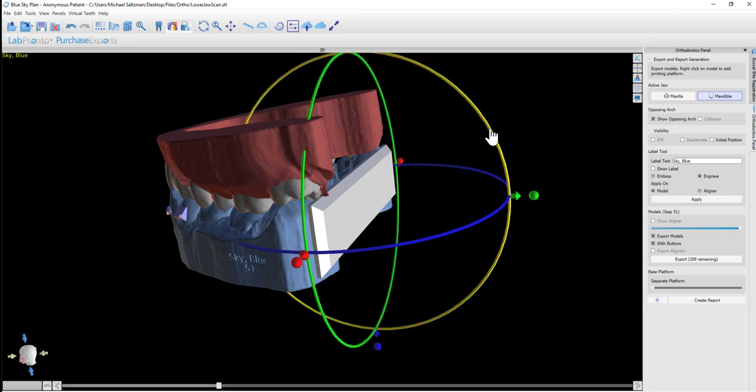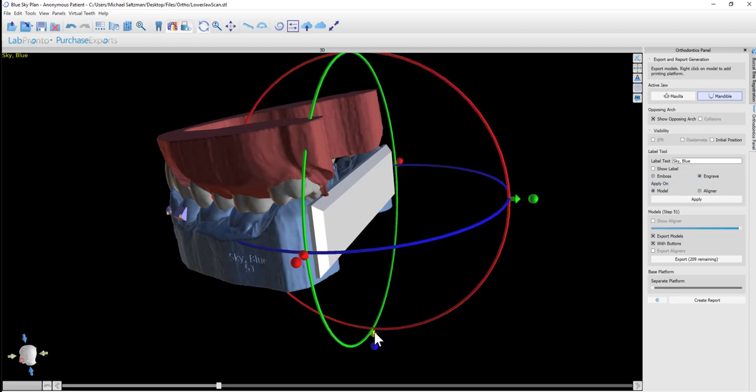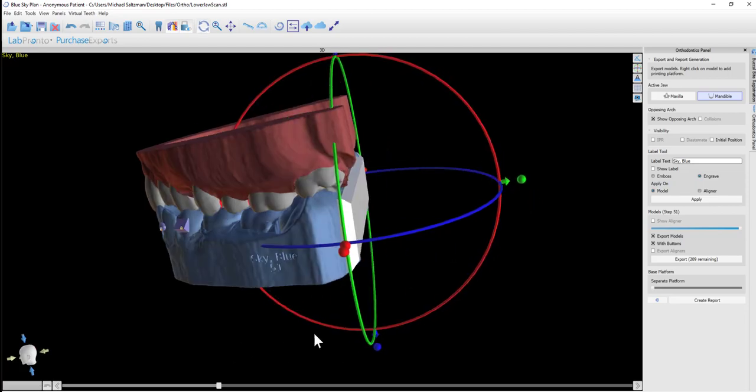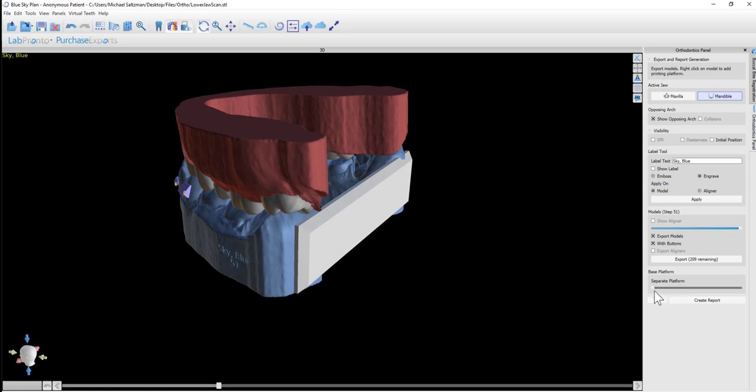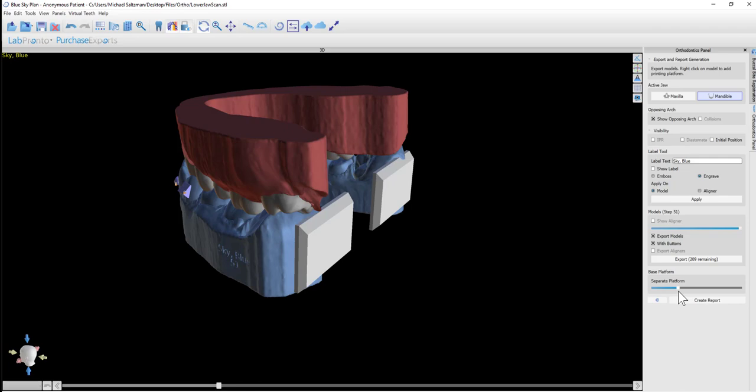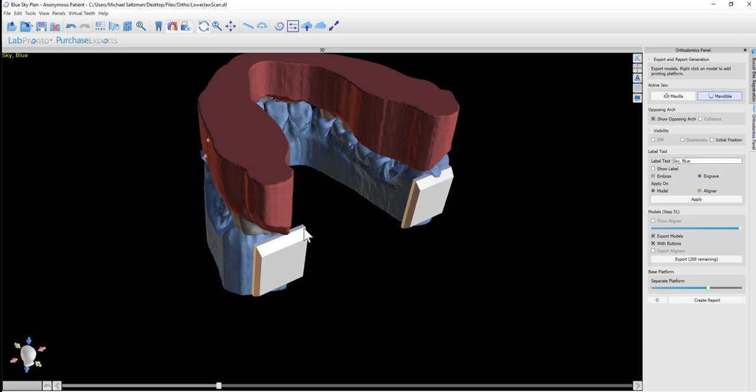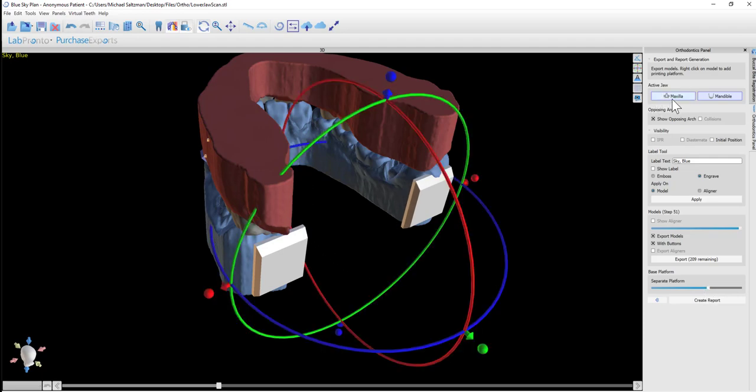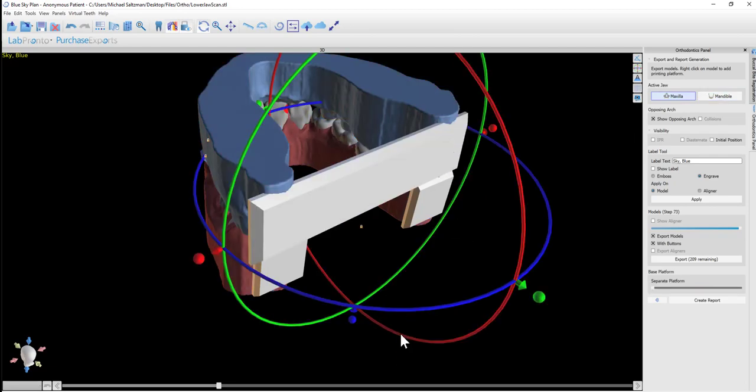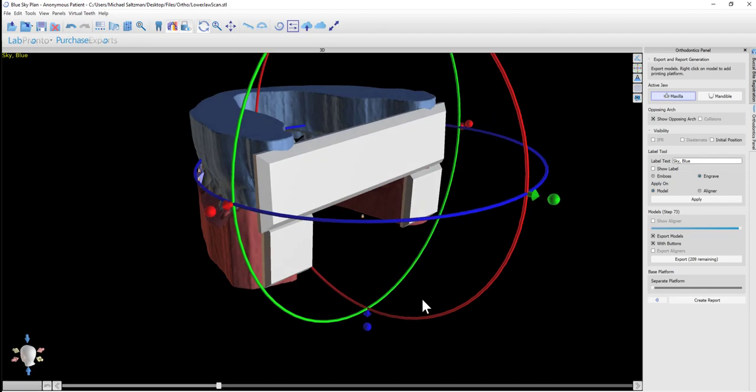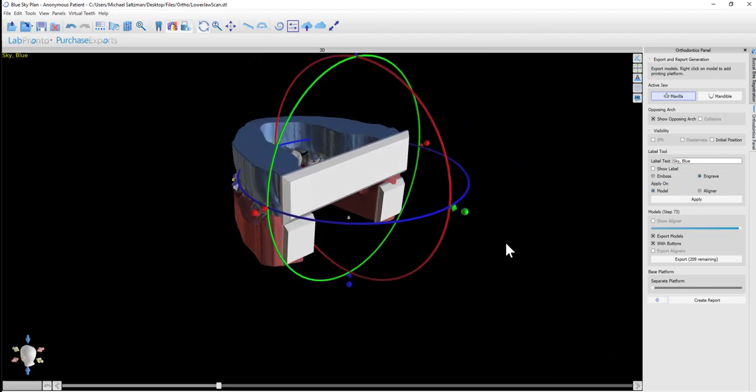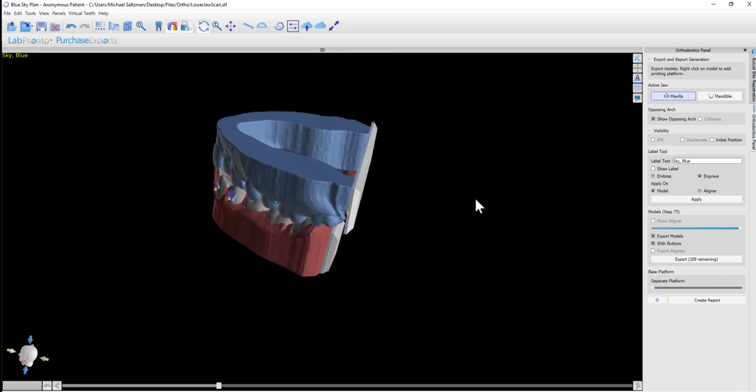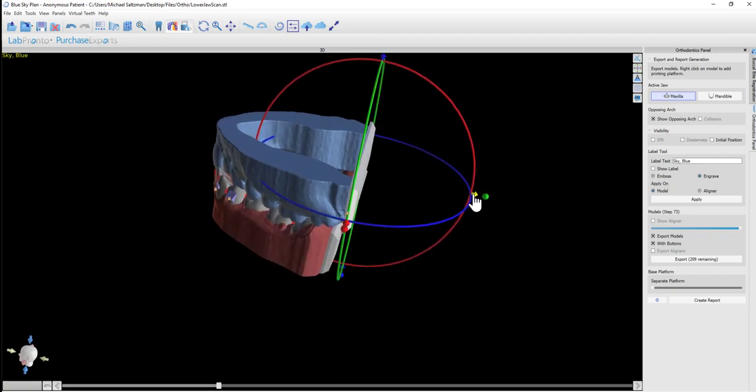If we want to rotate the platform, that could be done as well. Some people prefer to print using an angled platform. Once we are done with the positioning, we also have the capability of separating the platform. So instead of one continuous platform, you actually have two platforms. This could further save on printing material and reduce the printing time.